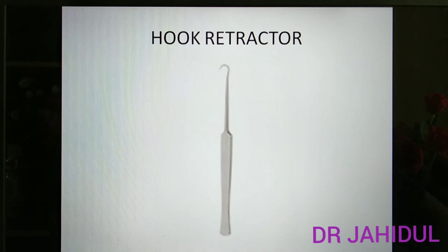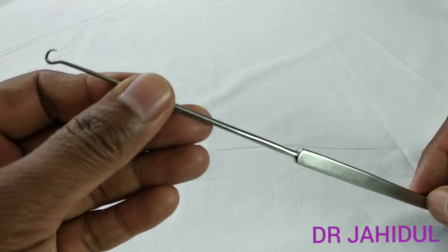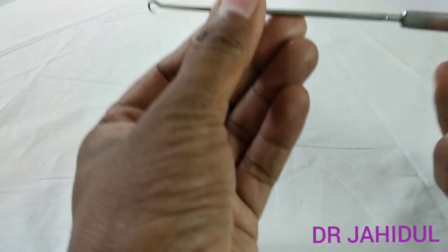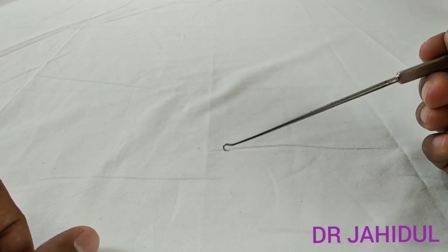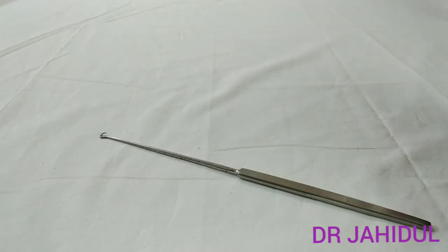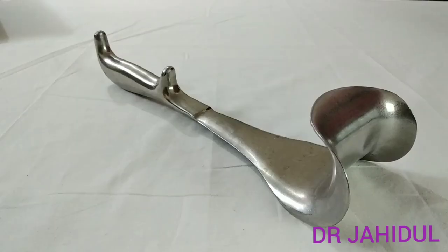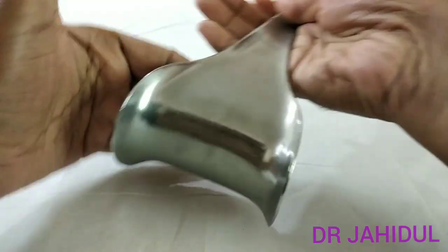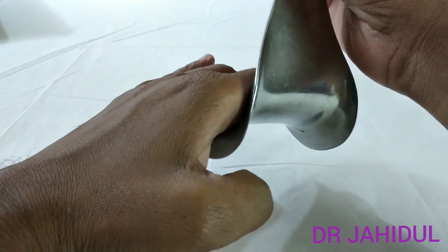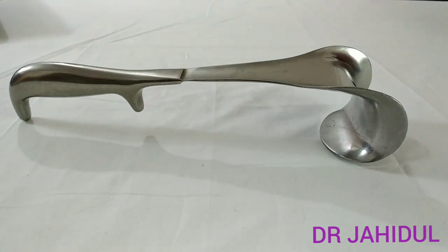This is the hook retractor. It has a hook at the tip which may be blunt or pointed. It is used to raise skin flaps by plastic surgeons and to retract skin in sebaceous cyst or lipoma excision. It is sterilized by autoclaving. This is Doyen's retractor, a very favorite instrument for obstetricians. It has a very wide blade and is used in pelvic surgery to prevent bladder injury. This instrument is also sterilized by autoclaving.